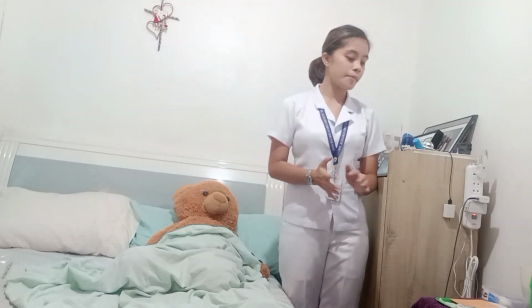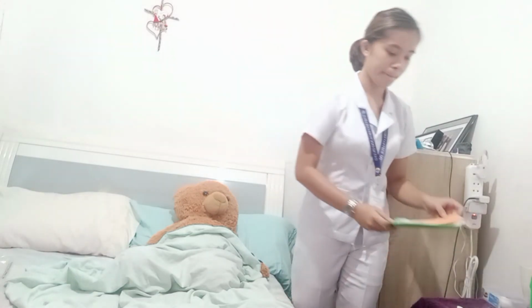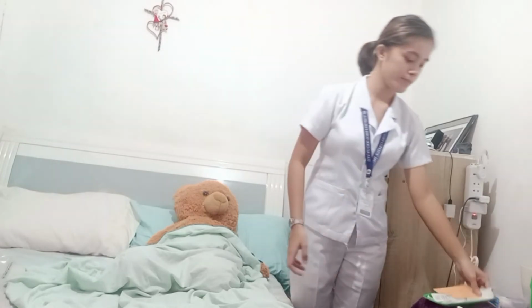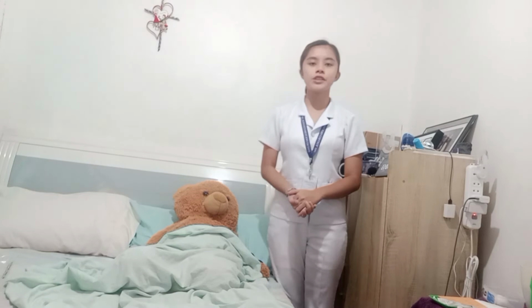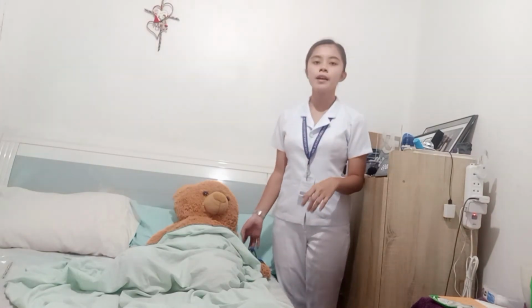Now arrange the medication card on the hypodermic tray with the corresponding drug. Organization and planning result in economy of time and effort and minimize confusion. Now select an appropriate site for the injection. This time I will use the deltoid muscle of my patient because it is close to the lymph nodes located just under the armpit.